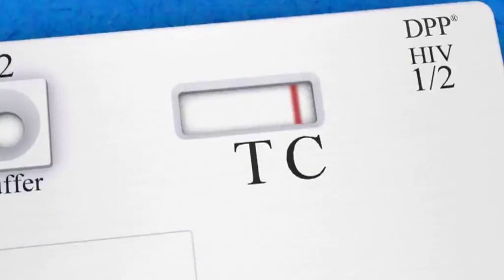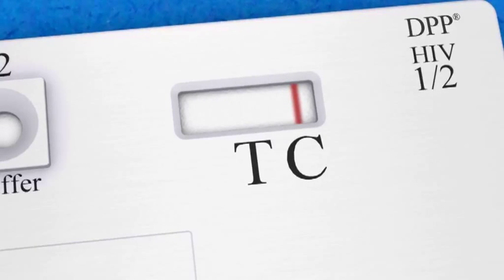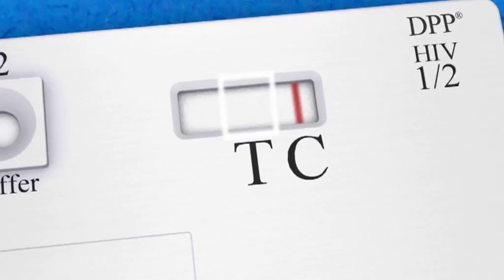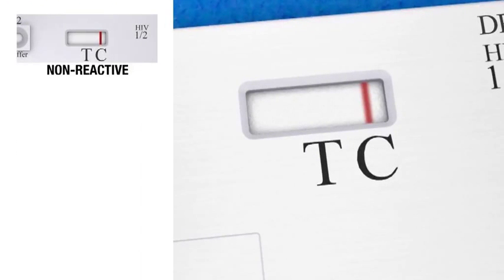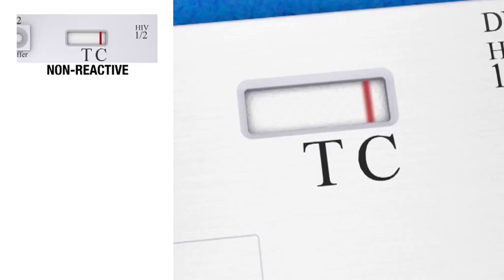First, make sure that a reddish control line has formed above the C marking in the test window. If no control line is visible, then the test is invalid and a new test must be run. If no line has formed above the T marking in the test window, the result is non-reactive, meaning that the patient is preliminarily negative for HIV-1 and or HIV-2 antibodies. Be aware that this does not necessarily exclude HIV infection.